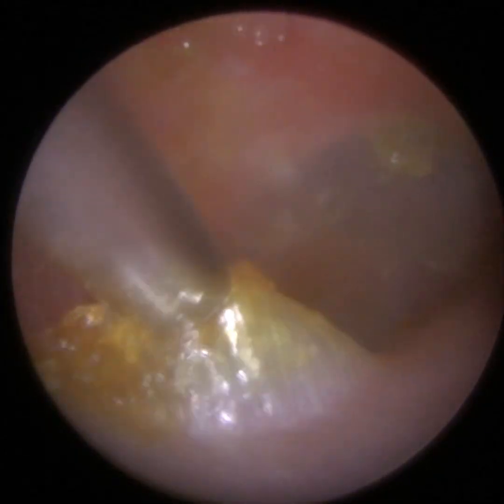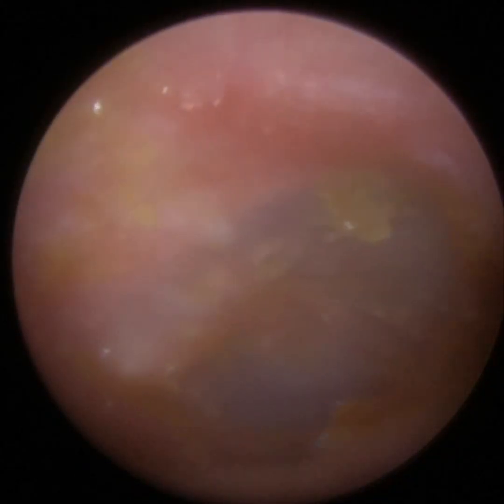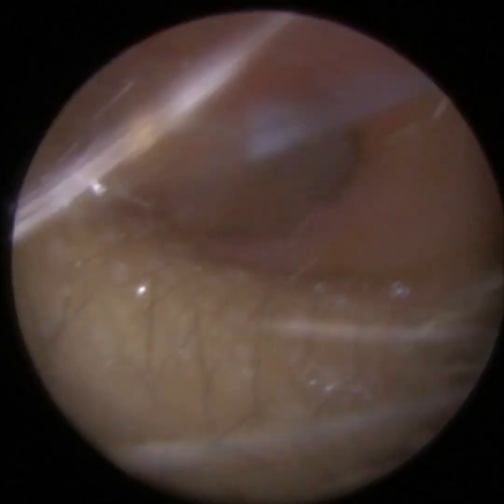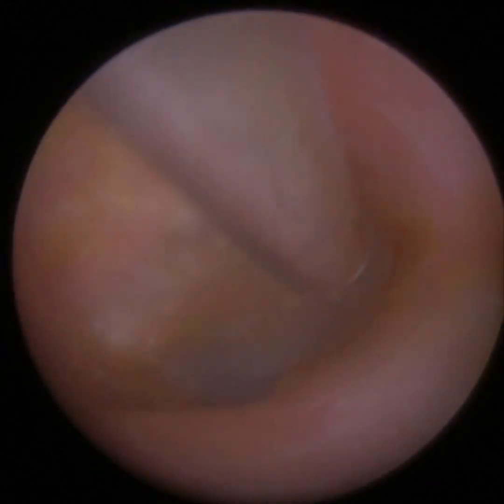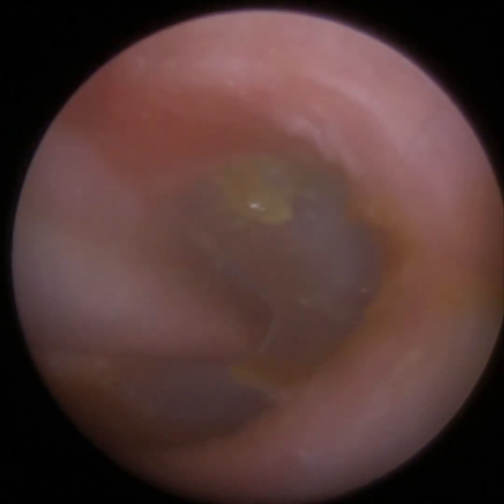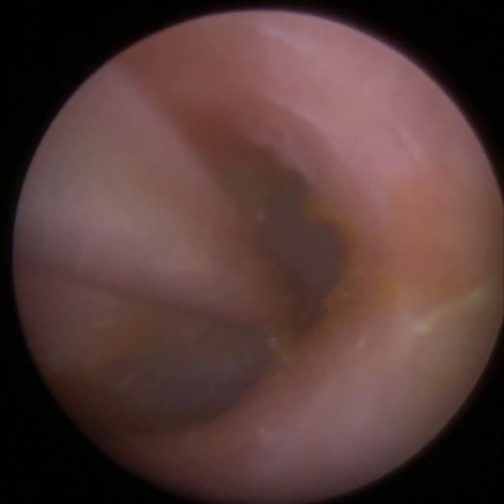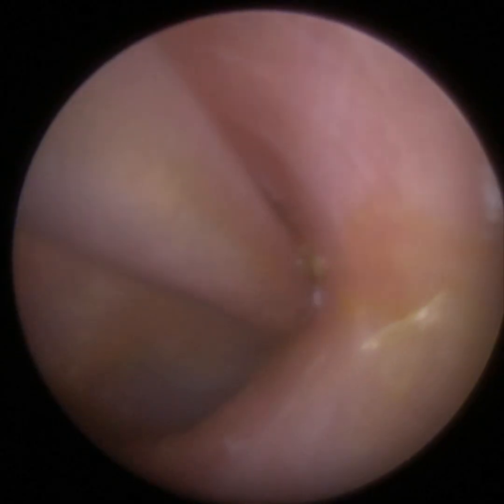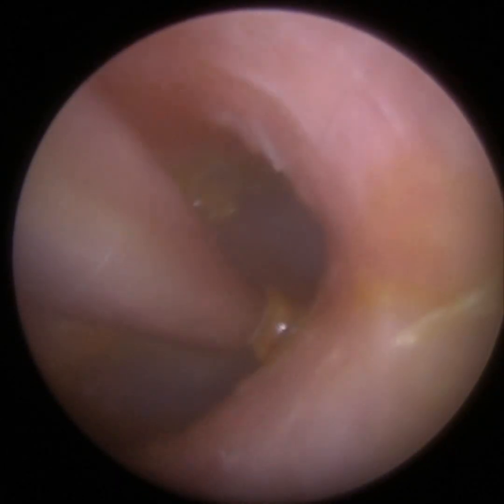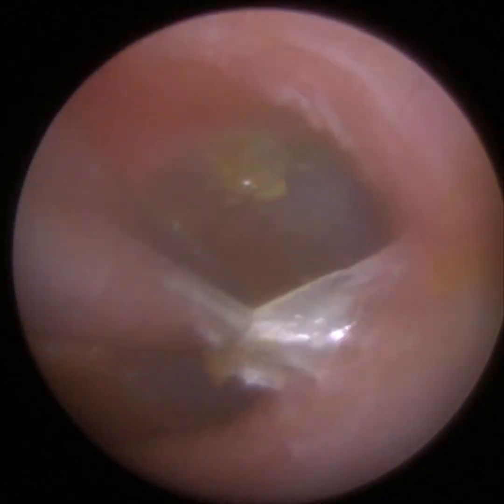So just some left here on the anterior canal wall, mid wall, some dead skin, just peel that off. I still think there's a bit more at the base on the inferior recess. Now, it may not be visible to the naked eye, but I can just see a thin sliver of skin here. Really, really thin sliver, I have to be really gentle. And I just about managed to get it out. You can see there. On the right-hand side, you can see this. There we are now. And I'm just lifting that up and away and then out. I have to lift it up out of this trench. There we are. So we managed to get all that out.